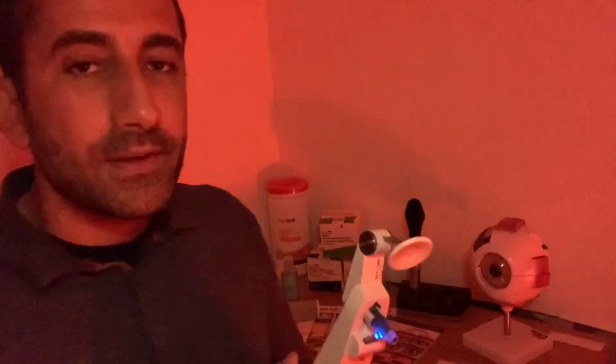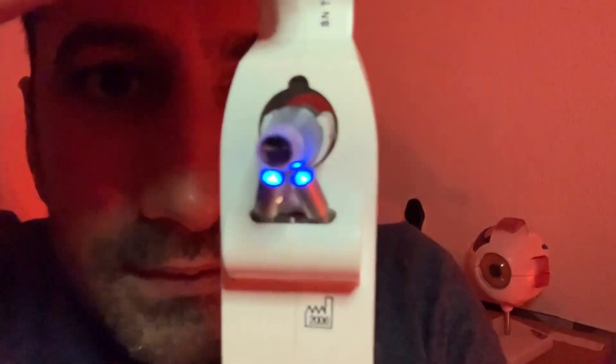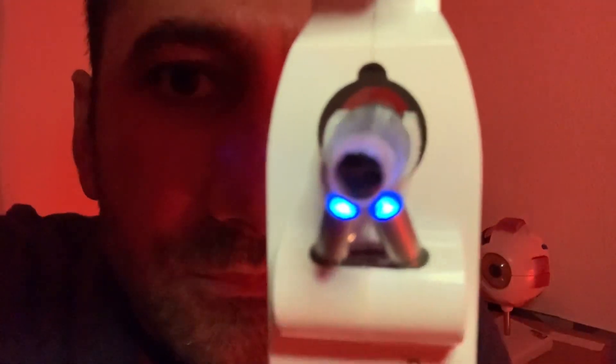Good — so it looks as though we have a reading of 13 millimetres of mercury there. Okay, and for the left eye, looking straight. The eye pressure has reduced a little bit somewhat.